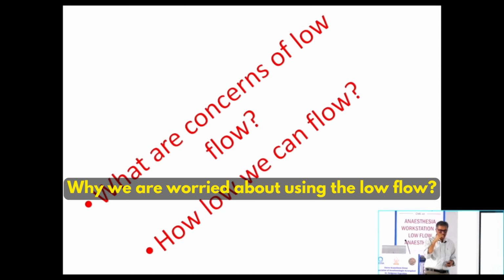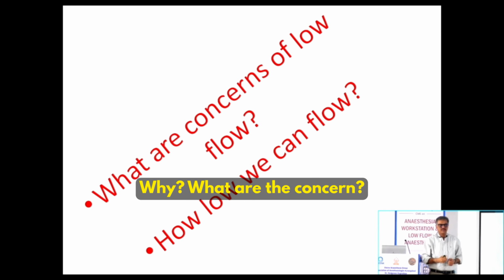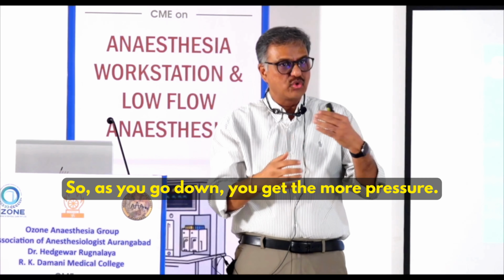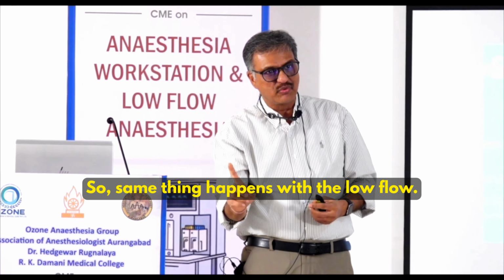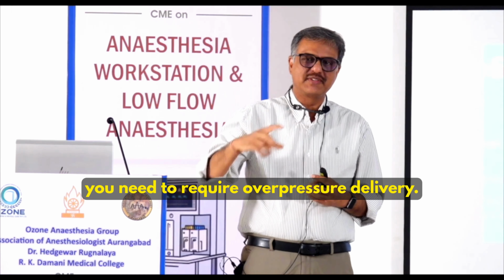Why are we worried about using low flow? A little bit hesitant to start with the low flow. Why? What are the concerns? Pressure is a concern. As you go down, you get more pressure. The same thing happens with the low flow. As you go down, you need to deliver over pressure.